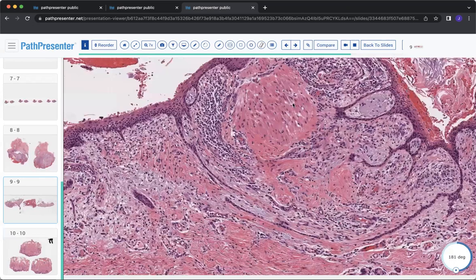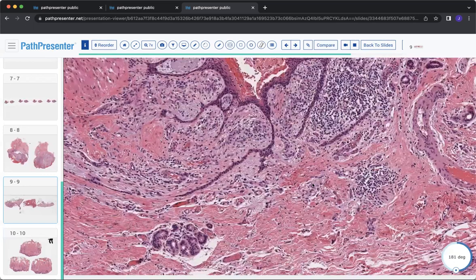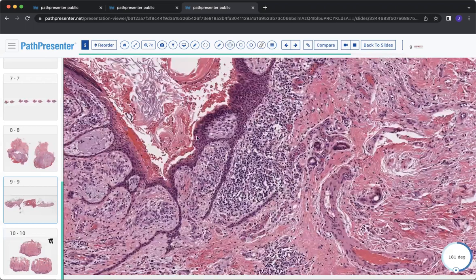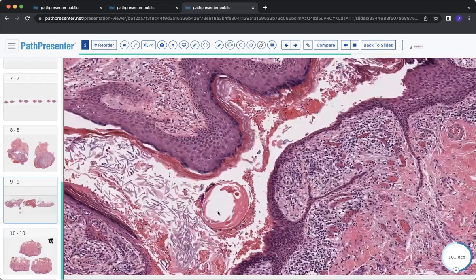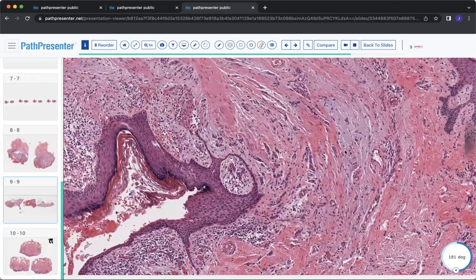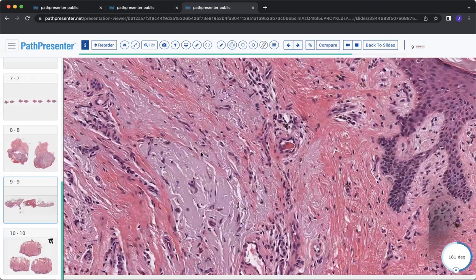So you have a lot of just fibrous, almost some areas that look like fibromucinous stroma, some areas of thin keratinocyte islands reticulating together, some maybe overlying hyperkeratosis. Again, I hope you can appreciate these thin little branches of keratinocyte-derived islands here. And none of it looks malignant.